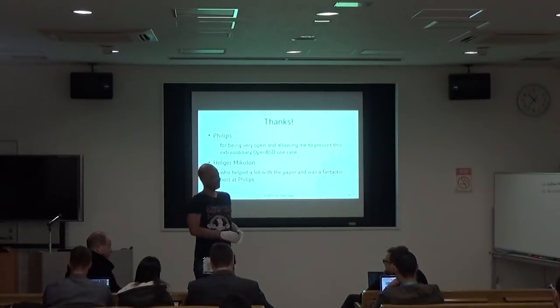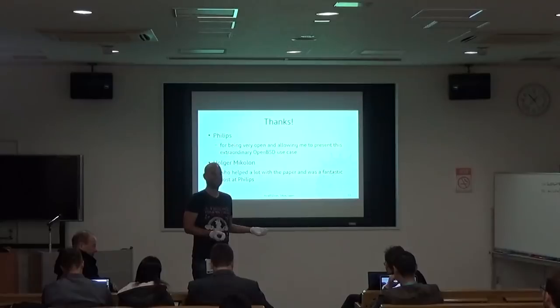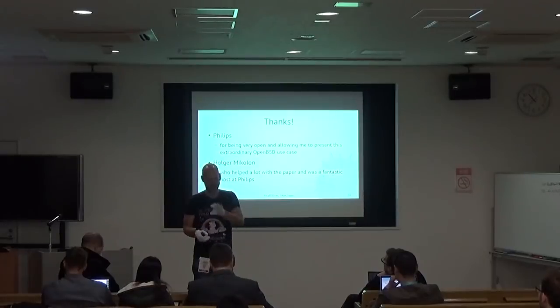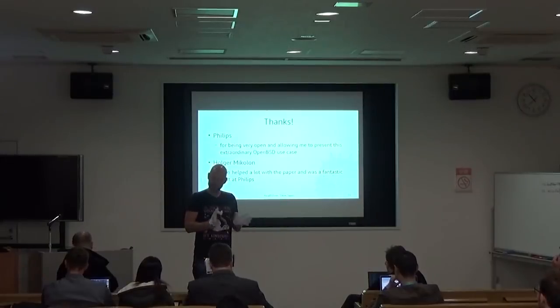I guess the observation is more like, the operator's workstation runs Windows, yes. So at the end, even if the certification was perfect and you bring it onto the Windows machine, where is the risk? Well, at least it's completely isolated from the outside. Oh yeah, absolutely. This is all behind the OpenBSD machine. There's basically no way to access it from the outside except sending X-ray picture requests and sending the records back with images attached. So that is a pretty sane setup.